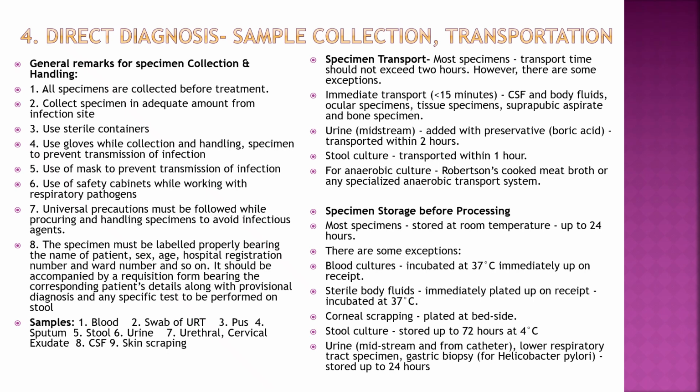Storage before processing: most specimens are stored at room temperature up to 24 hours. There are some exceptions. Blood culture is incubated at 37 degrees Celsius immediately on receipt. Sterile body fluids are immediately plated on receipt and incubated at 37 degrees Celsius. Corneal scraping is plated at the bedside. Stool culture is stored up to 72 hours at 4 degrees Celsius. Urine is collected midstream or from the catheter. Lower respiratory tract specimens and gastric biopsy for Helicobacter pylori are stored up to 24 hours.